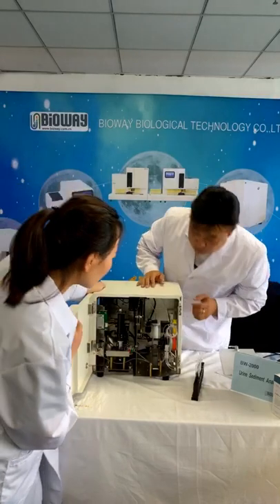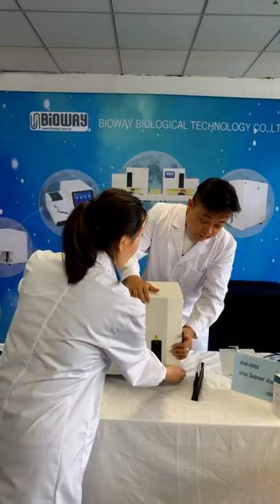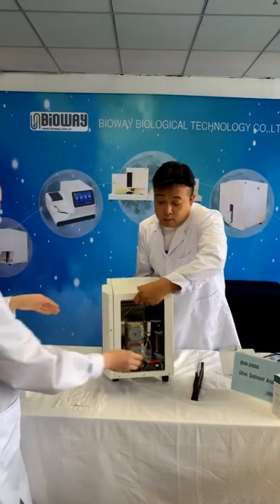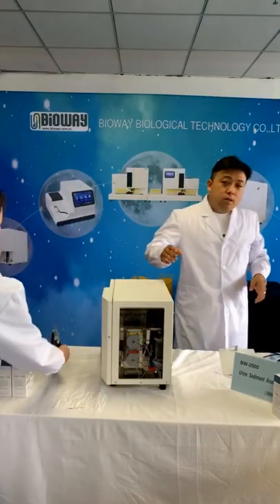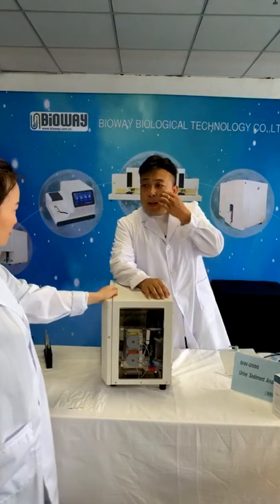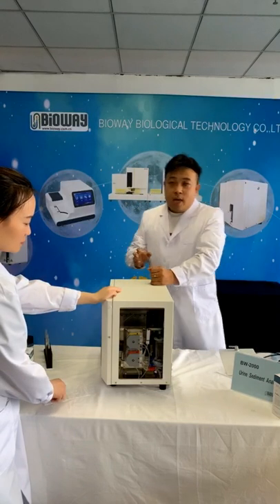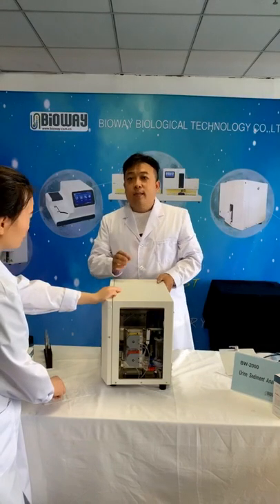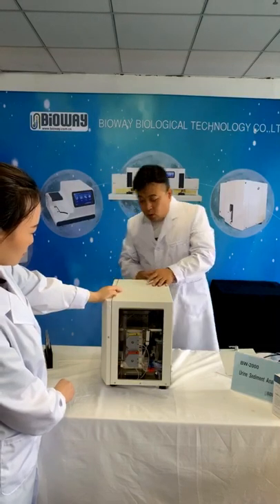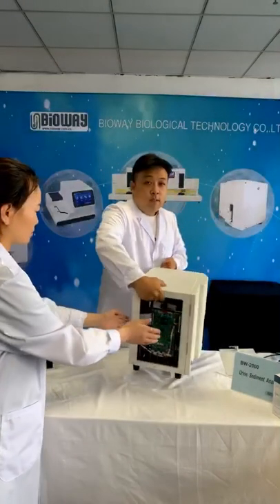So here there's a pump. You can see here that there are two pumps over there. The two pumps are there to help you clean the machine, clean the different samples, clean the pipeline inside, and even the flow cell. So the pipes and the board, we can see that.